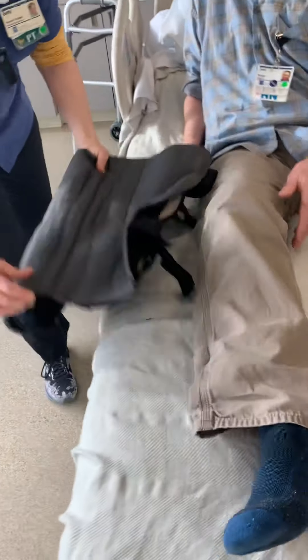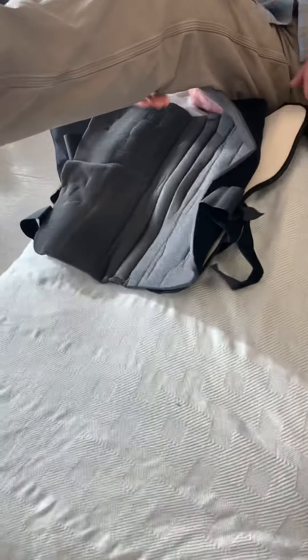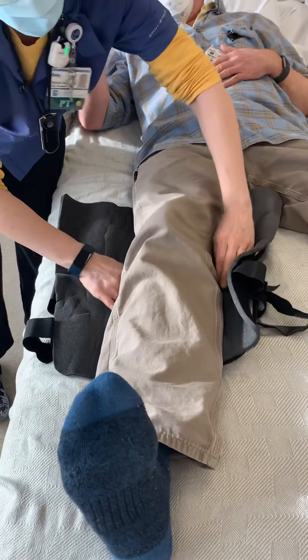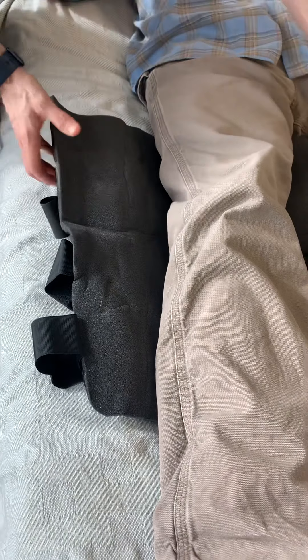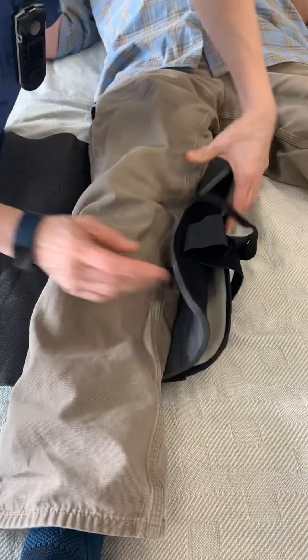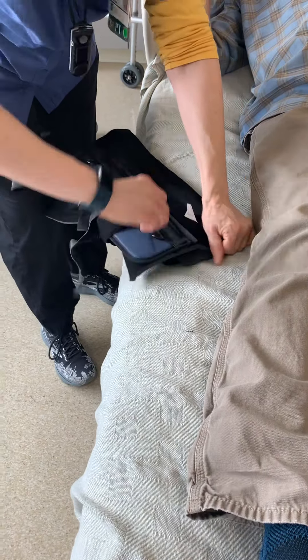So when they are putting this on the leg, you're putting the indented part right behind the knee. Go ahead and come on down there Joel, let's see how close it is. You usually want that rigid upright piece right along the back of the leg. So then when you go to close this up — I did this kind of wonky because I changed one side. Let me fix this a little bit here Joel, we're just going to readjust so it's the same on both sides.